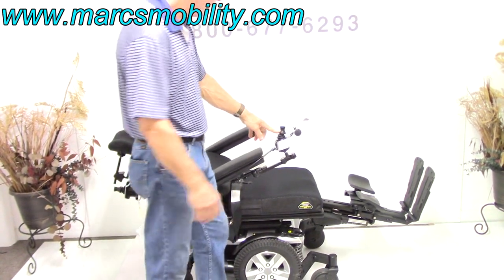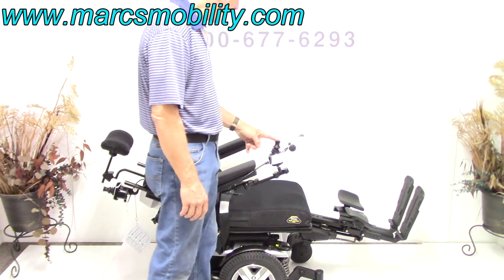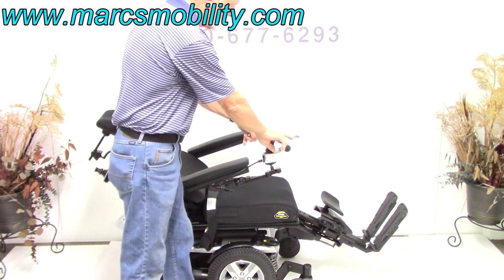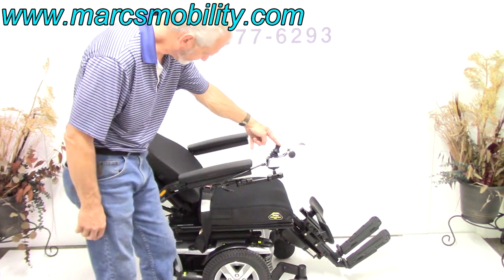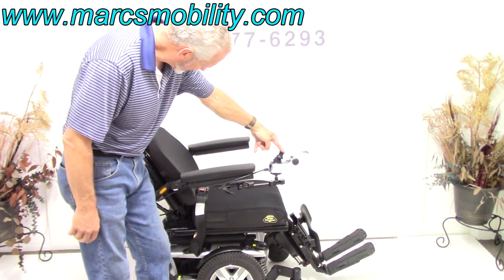I'm going to bring the recline back up. As a matter of fact, I'm going to do two functions at once — the recline and the legs at the same time. I just need to put both of them in yellow on the screen; that can do two functions at once. So the legs are coming back up and the back is coming back up.